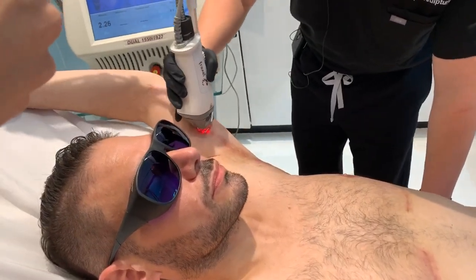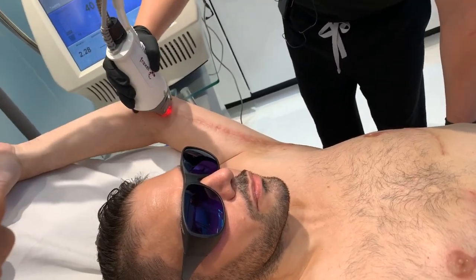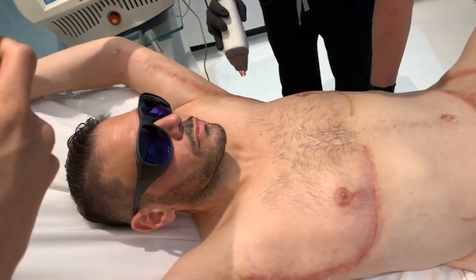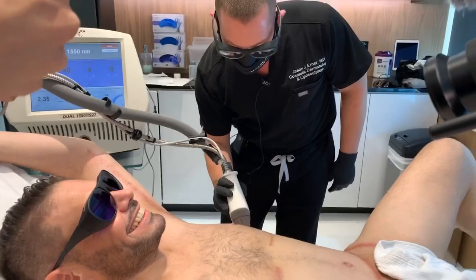This is going to help us remodel. The first treatment we do a little bit lighter. The second treatment, which will be 3 to 6 weeks from now, we'll do a little bit stronger. But he is honestly bionic because he's healing so fast on his own, which is unbelievable.